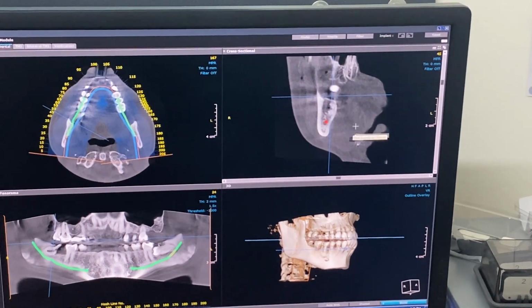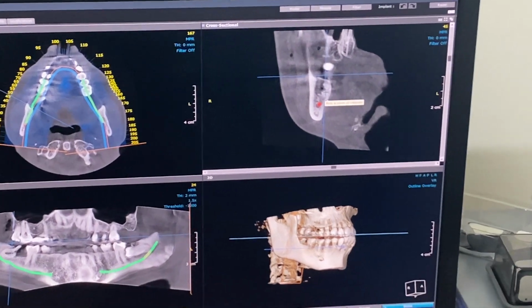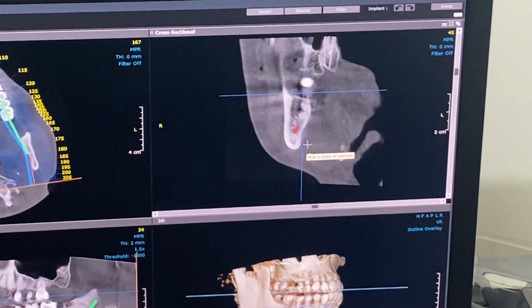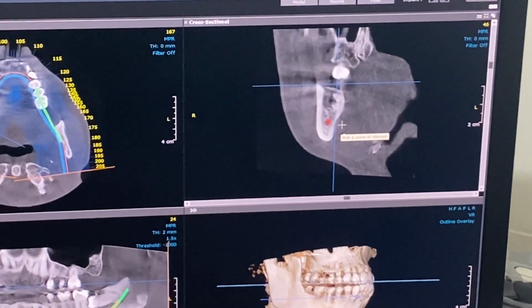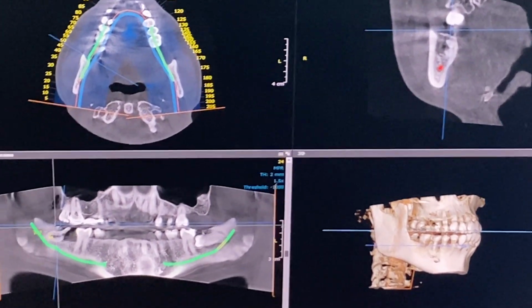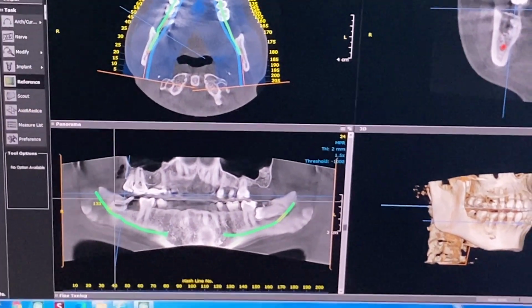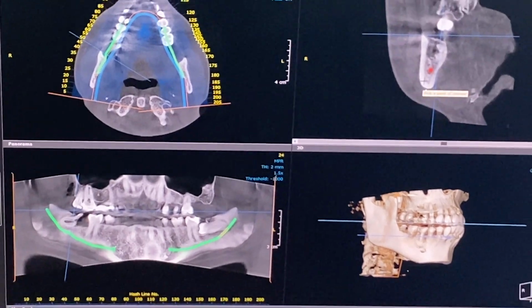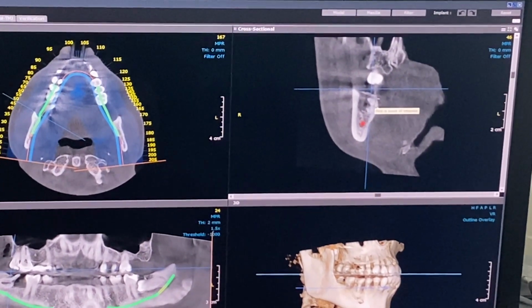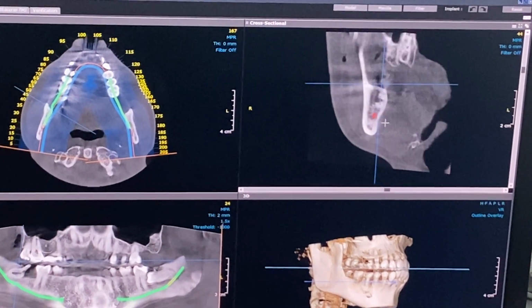And you can see this is the lingual side, this is the buccal side. The tooth is fairly well pressed onto that lingual plate, and knowing that now, when we do this surgery coming up, we're designing a distal wedge here on the superior part of the root, and we're going to very, very carefully split these roots and take them out. But I can move up and down those roots with confidence where we are.